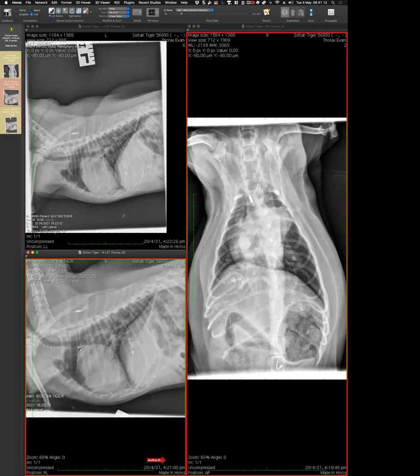Okay, so if we add that ingredient to the salad, how can we explain this? Because we had a PDA last time. That's why I put the PDA in last week's rounds. And can someone give us a brief summary of what we've seen last time? Because that's the classic. Do you remember?